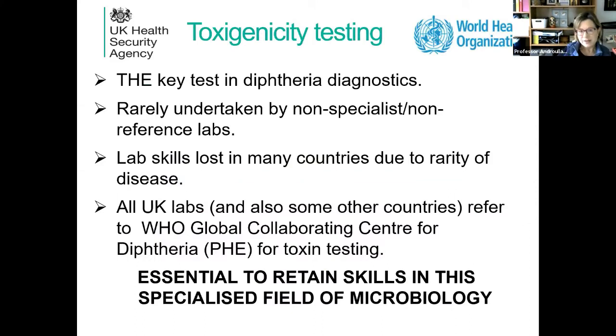However, the key test in confirming a case of diphtheria is the test for the detection of the lethal diphtheria toxin. This is a test which is not usually undertaken in a routine diagnostic lab. It's usually undertaken in a reference lab. And unfortunately, laboratory skills in toxigenicity testing have diminished in many countries because of the rarity of the disease. This is the perception, certainly in Europe.